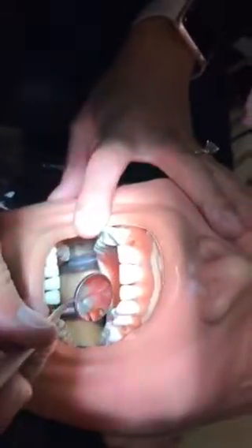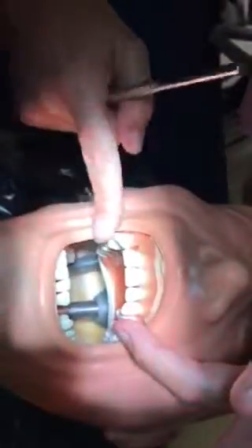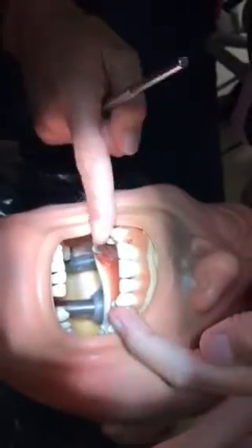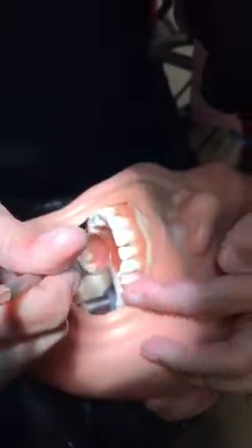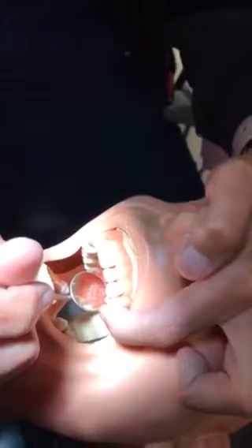So to do the anterior dental dam with clamps, I'm gonna first examine the mouth. When I do the dental clamps with the anterior, I am gonna go from first premolar to first premolar. Since I'm doing maxillary, that's gonna be tooth number 5 to tooth number 12, okay? I'm gonna look at the mouth first, and he is missing his lateral again, so we're gonna not punch that hole. And since I'm going to first premolar, I don't have to worry about this space in the back. The clamp is gonna go over this premolar.